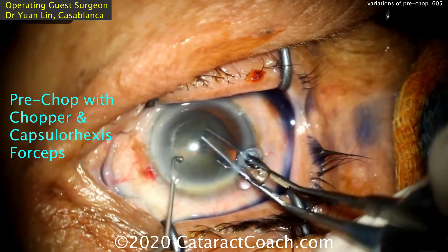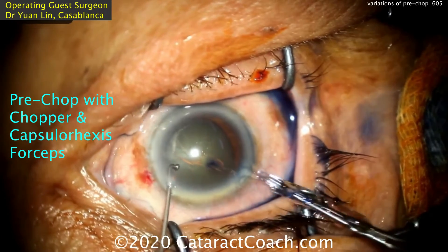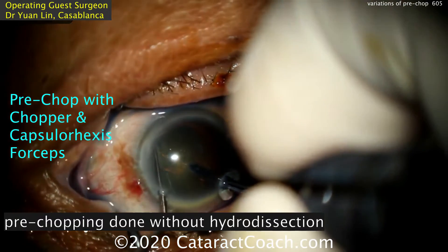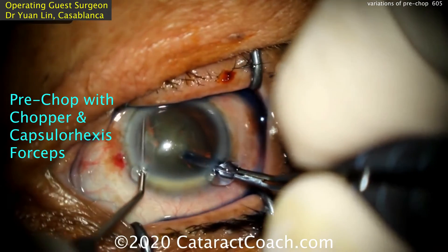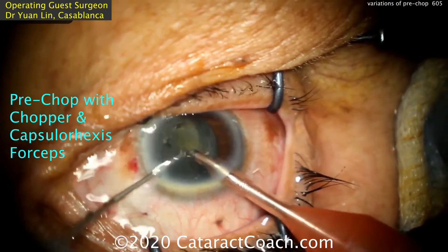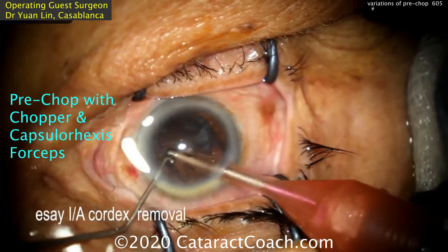Dr. Lin even does pre-chop with just the capsulorrhexis forceps and the chopper — no additional instrumentation, no wasting of time or steps. Placing the capsulorrhexis forcep in the eye, the forcep tips hold the nucleus still while the chopper does the work. Splitting the nucleus into halves beautifully, and this can be repeated to split it into quadrants. So clearly to pre-chop, you just need two instruments in the eye — almost any instruments you want — or you can use the specialized Akahoshi pre-chopper.